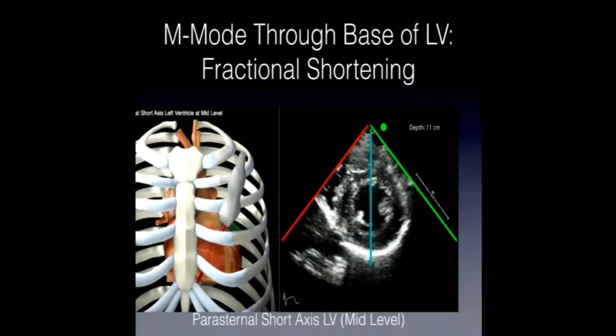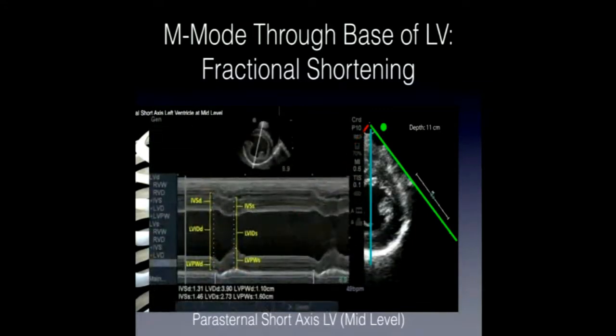And so you can throw the probe on, as I've stolen from this Toronto website. I should reference that. Cutting the left ventricle in short axis, we have a nice donut on the right side, and we've put down the ice pick line through the middle, and now we will develop this graph, and we can see from diastole to systole how much contraction or shortening has occurred, and if it's greater than 25%, that would be considered normal. Okay, so again, this can be misrepresented. If you have an apical aneurysm or wall motion abnormality, then you're not really capturing that there's a problem in the apex of the heart. So it's not a perfect method, but it's just something to note.